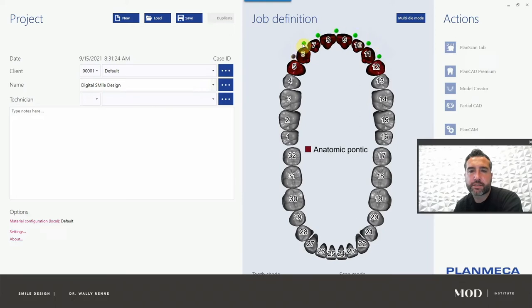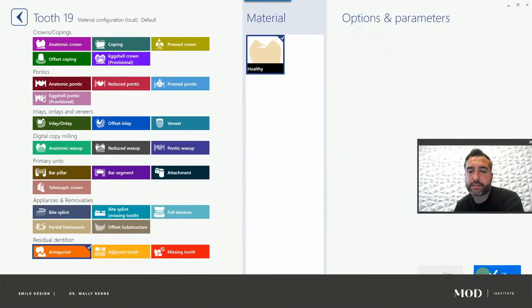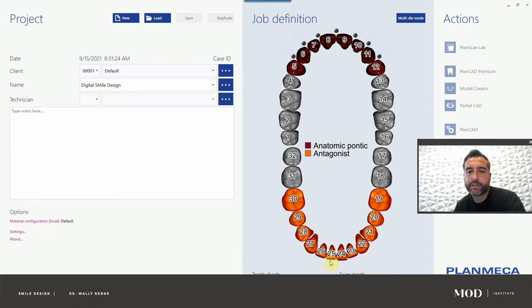The software is saying it's going to design these with connectors — those are the green dots. We don't need connectors; we're not designing an actual bridge. Just go ahead and eliminate those from the wizard by unchecking those boxes. They will turn from green to a dark slate gray. For the opposing, just click any tooth and pick antagonist — all this really does is prompt the software to ask you to load an antagonist.